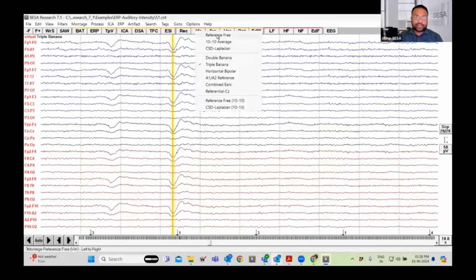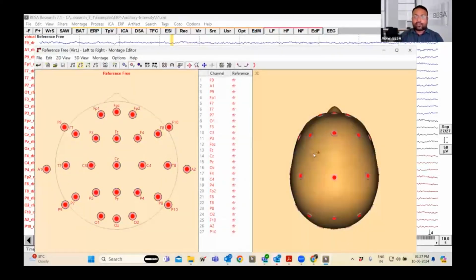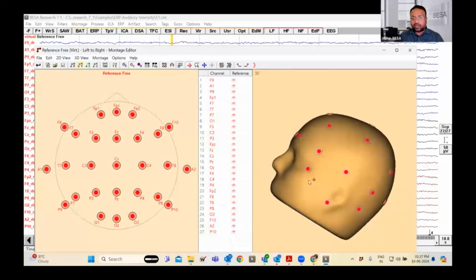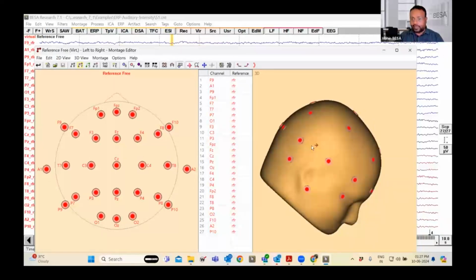Now, if you go to this reference free, you can see that there are 27 channels in the reference free. You have these virtual sources as well as source montages. And let us first see what the virtual montage is. In order to understand it more, let us click on this EDM, Edit Montage button over here. So clicking that should show you how the electrodes are placed over the scalp. So these are the standard locations, standard 27 electrode locations in which the electrodes have been placed.